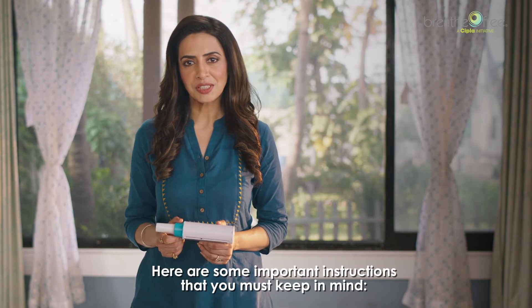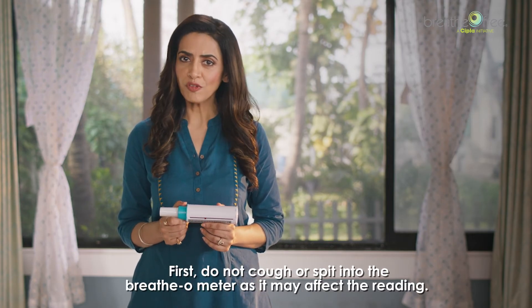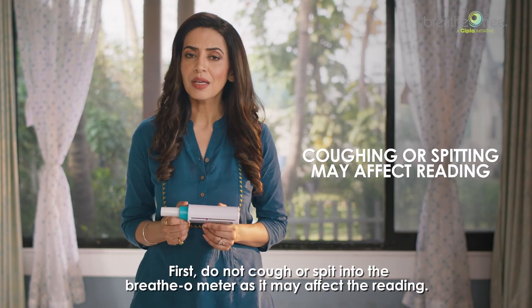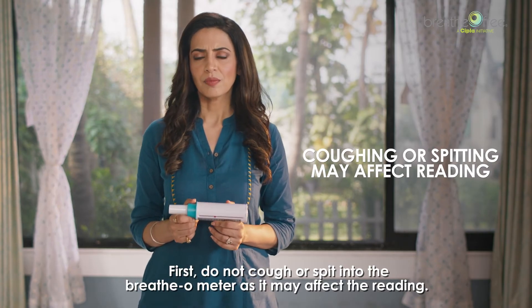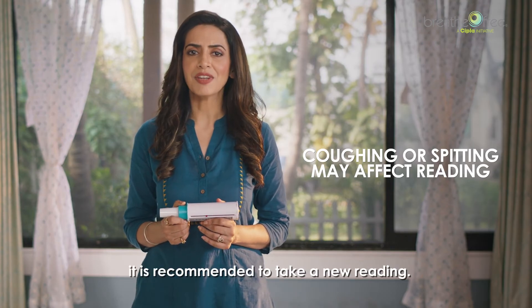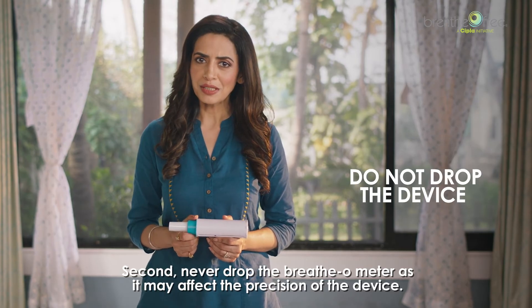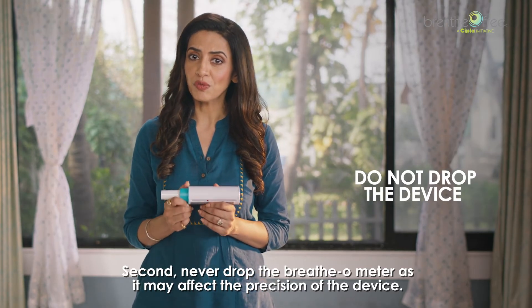Here are some important instructions to keep in mind. First, do not cough or spit into the breathometer as it may affect the reading. If you happen to cough or spit while taking the reading, it is recommended to take a new reading. Second, never drop the breathometer as it may affect the precision of the device.